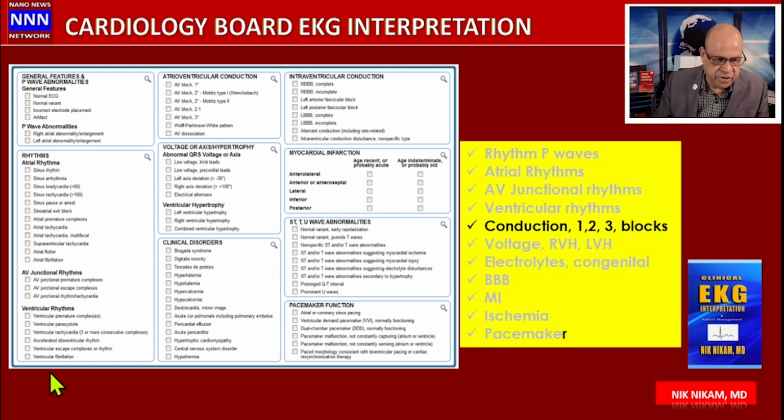And this is the template which I am going to be using, and I have prepared an overall presentation on this template along with separate videos for each one of these segments. I would like to invite you to watch those segments.